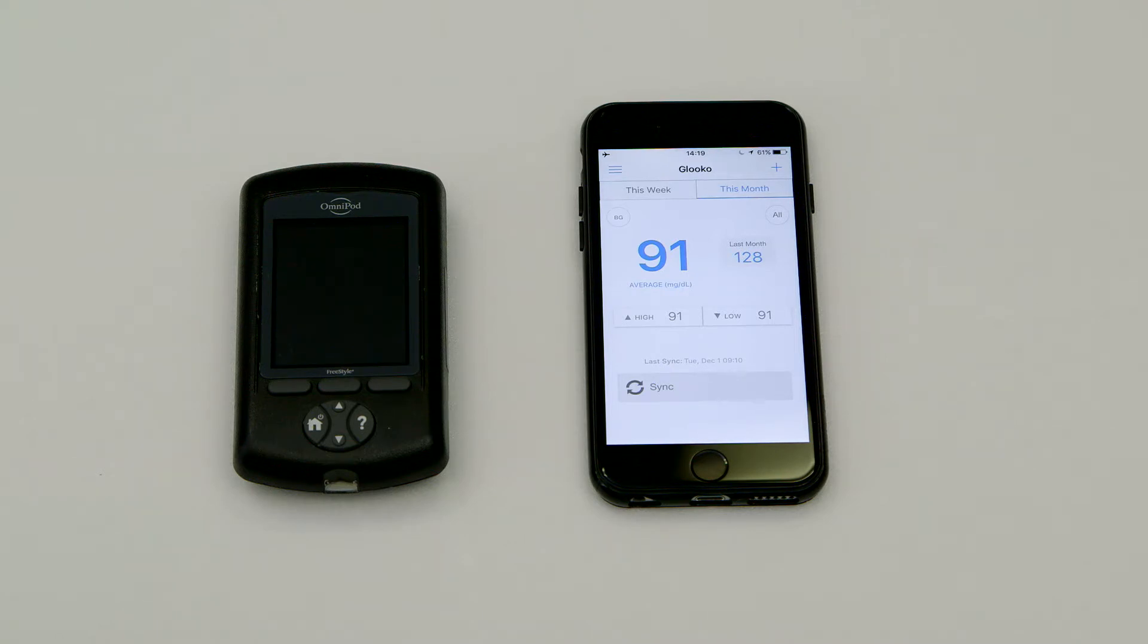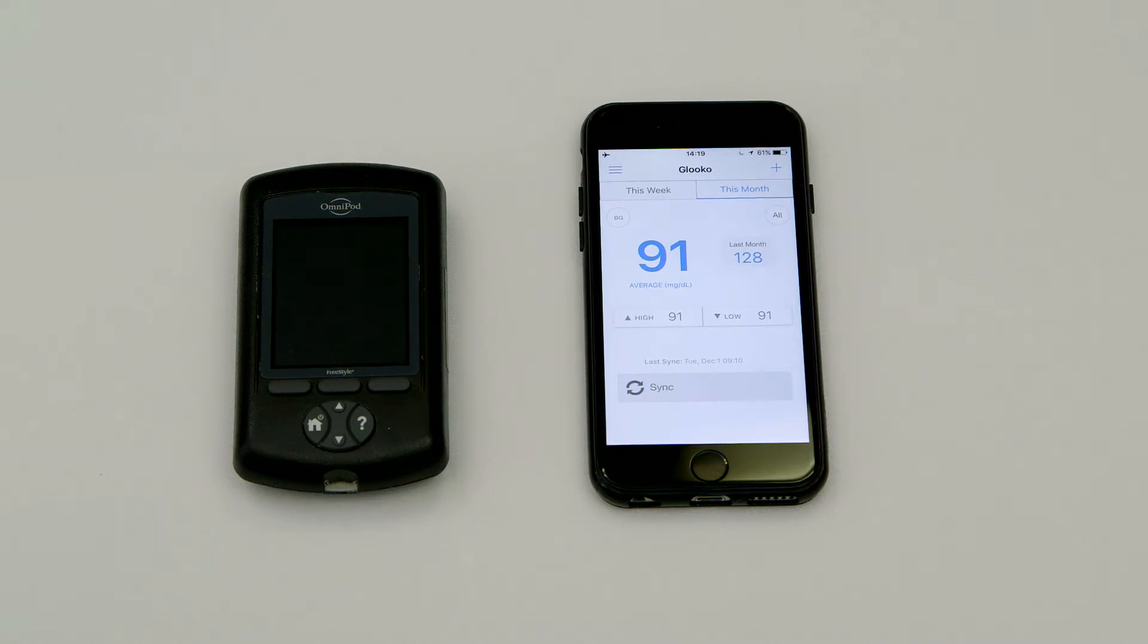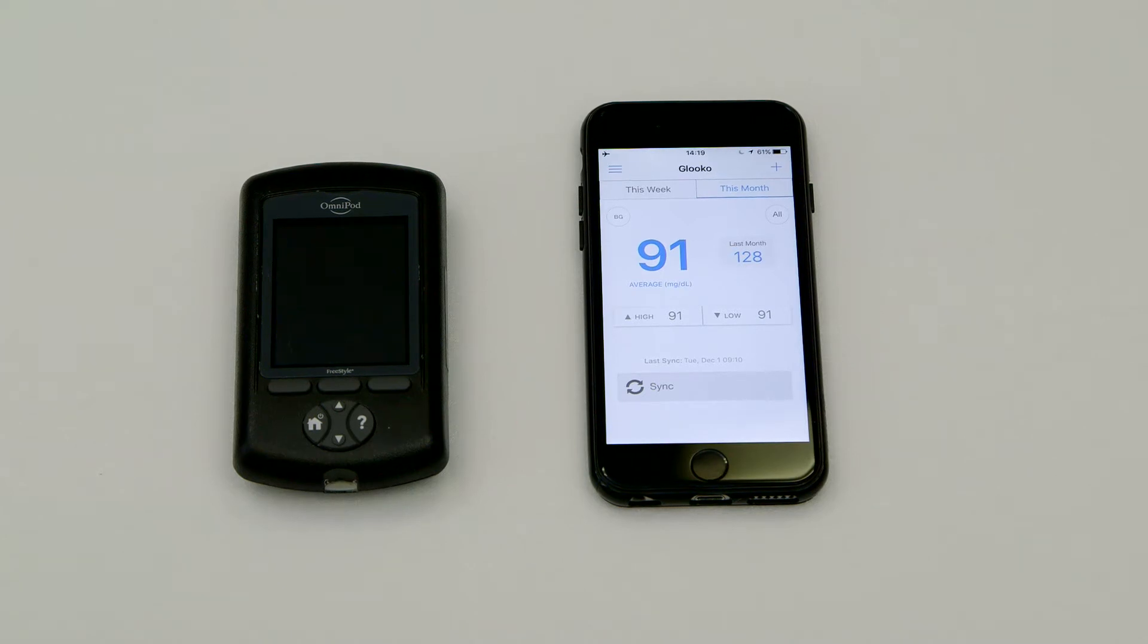Though you can't sync an Omnipod to an iOS device directly, you can view all of your PDM data synced from the web or from a supported Android device.